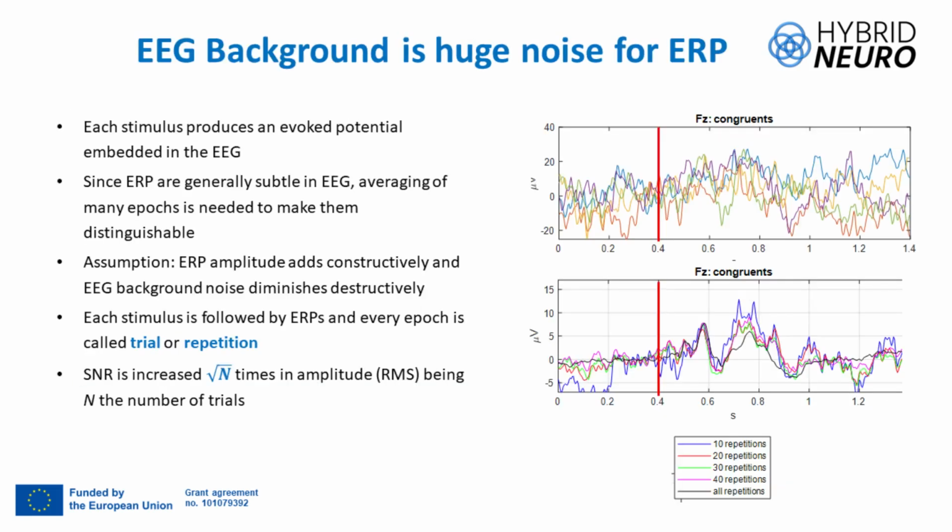Okay, we can see in this slide that I showed this potential very clearly here, but really this is not true, because there is a lot of noise because of the EEG background.